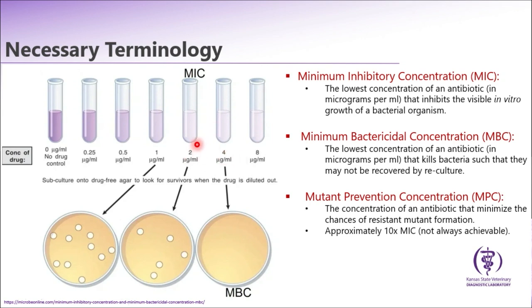Now at this specific concentration, the antibiotic is bacteriostatic, right? The bacteria is not visible to us, there is no visible growth, but that doesn't mean that all the bacteria are dead. And that's why we have the course of treatment over a few days or a few weeks, to continue inhibiting this bacterial population and control the infection over time.